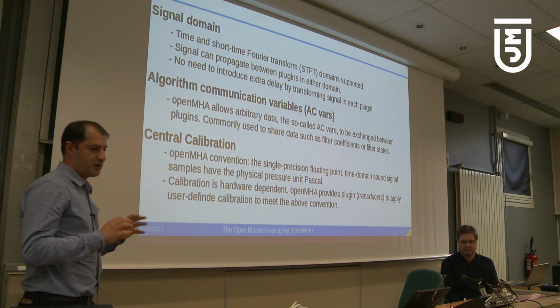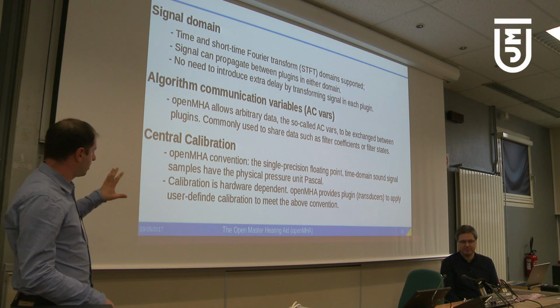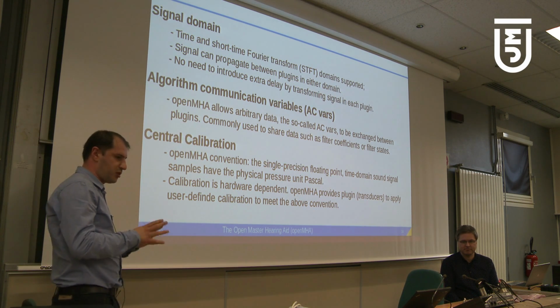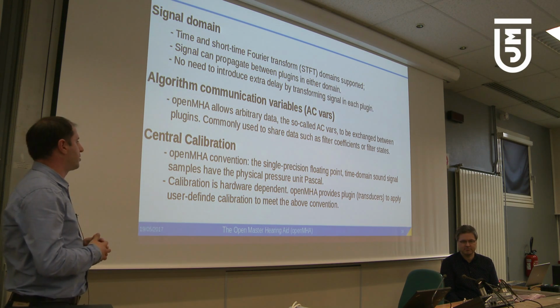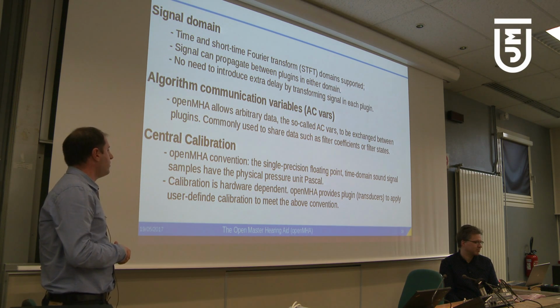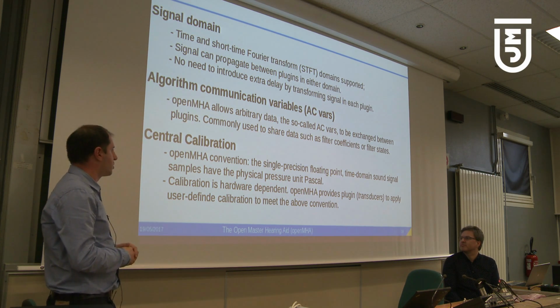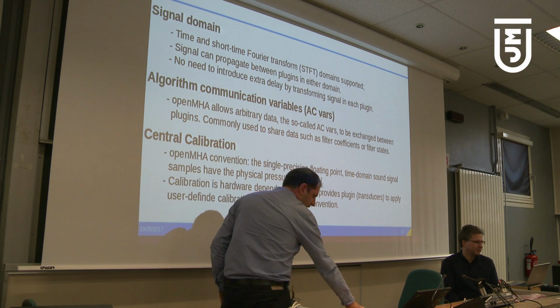In MHA, all plugins interpret the unit of the sound pressure wave in the same way: a floating point value is measured in unit Pascal. But since people use different devices, one needs proper calibration, and the plugin called transducers is provided to help users with this.